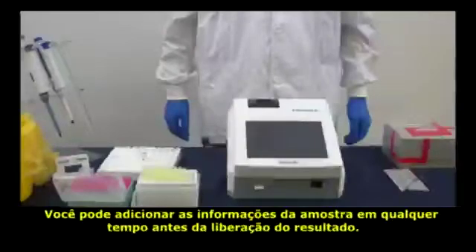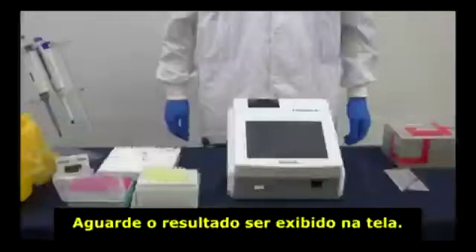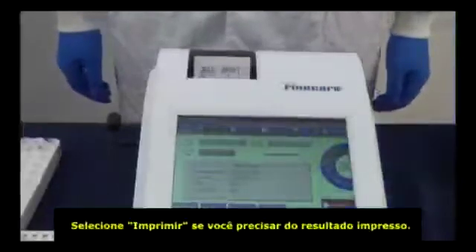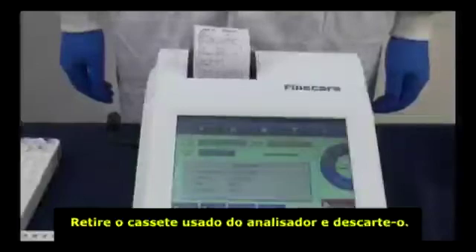Now we can wait patiently for the test result to display. Press Print if you need a paper copy of the test result. Then take out the used test cartridge and discard it.